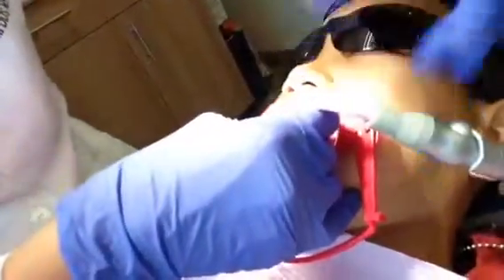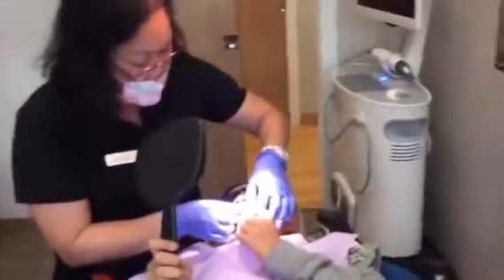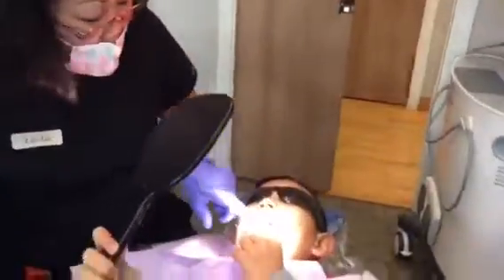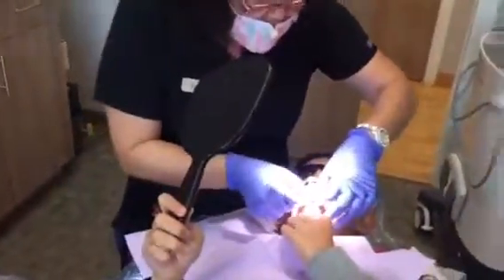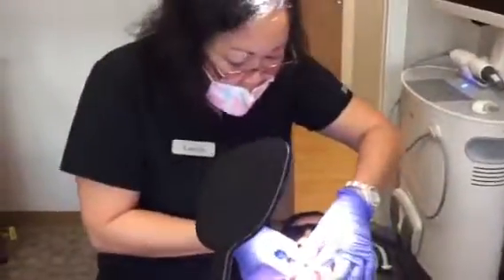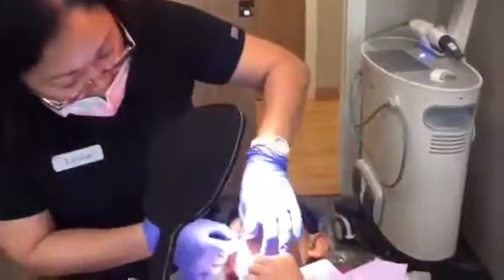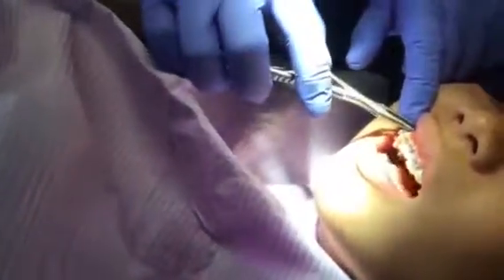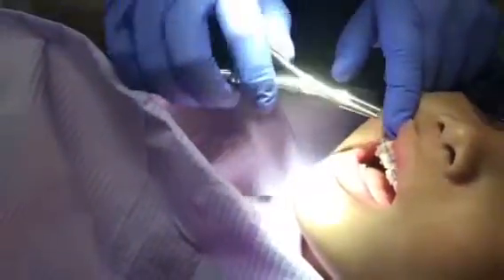You have to open. Open, Connor. Not my fingers — open, not close. They're like the little anchors. They work with this wire that I'm putting in. You're going to feel me press towards your tooth, you're going to hear a clip. Front clip, back clip — I'm going to engage the wire and place it into the back tube here. Now I'm going to go right around engaging your wire — this is called engaging your wire. Front and back clip. It takes a little bit of pressure. The wire is super soft and flexible today. I have a hemostat and here it comes — a little color. Don't move, don't move. I got it. Look guys — braces! Comment if you like the color.